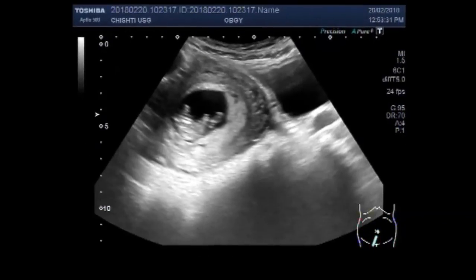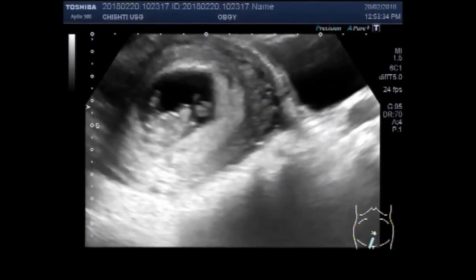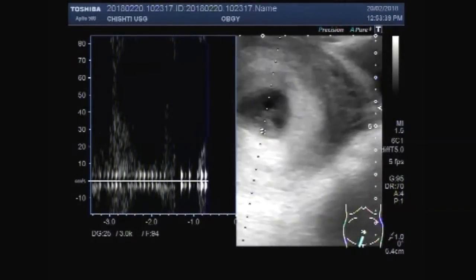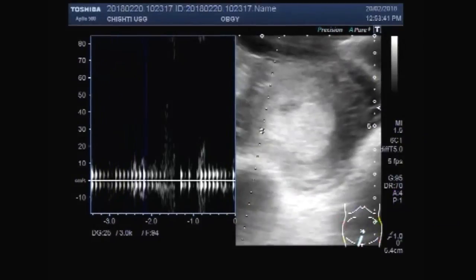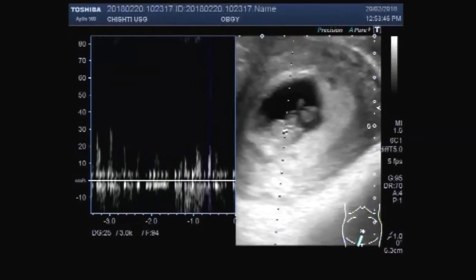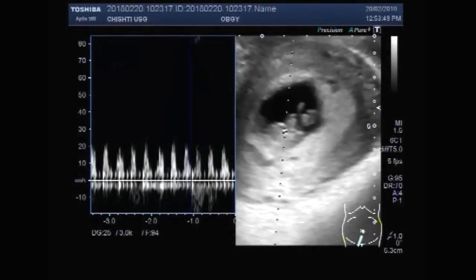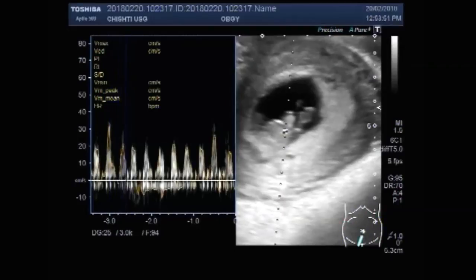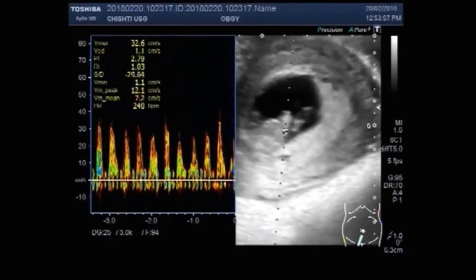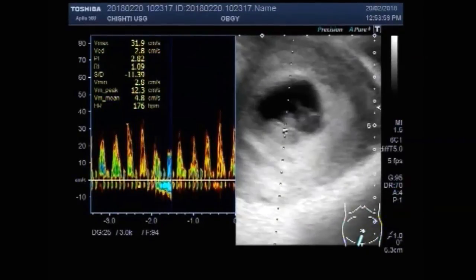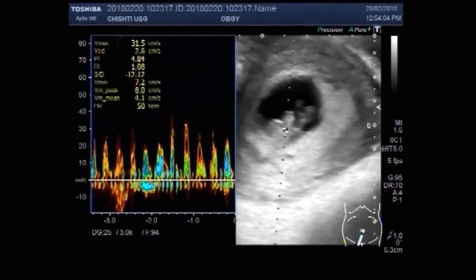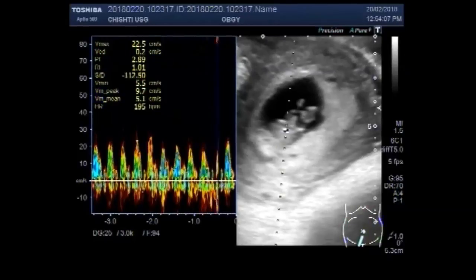Cardiac activity of the fetus is also visible. Again, the cardiac activity is seen. You can see the graph showing the cardiac activity.